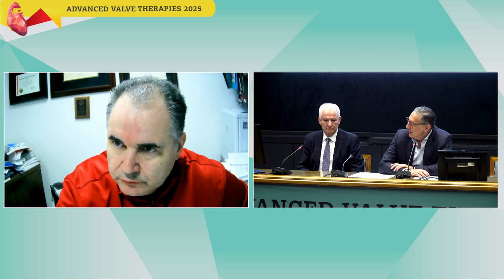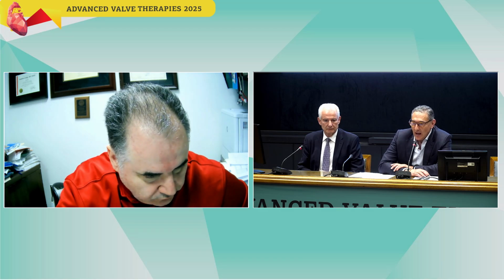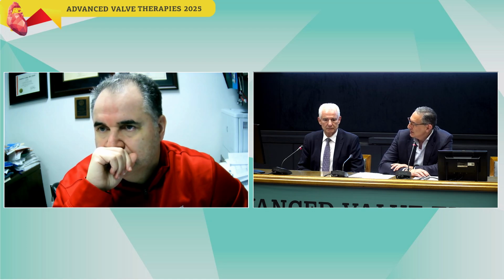That's all. If we have a 70-year-old patient with half the ejection fraction, and we measure 30 millimeters with this primitive tool, we will still ask the nurse to unpack a 30-millimeter valve.